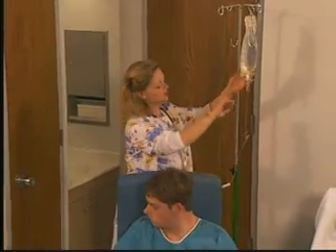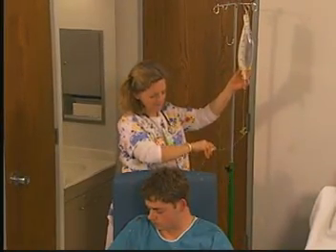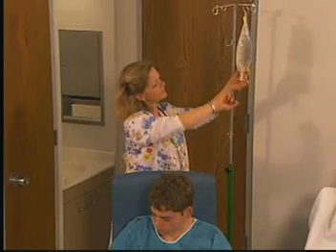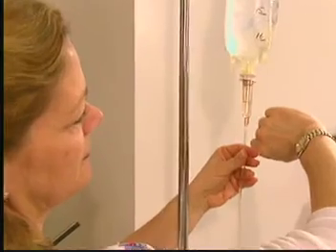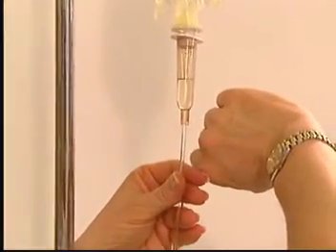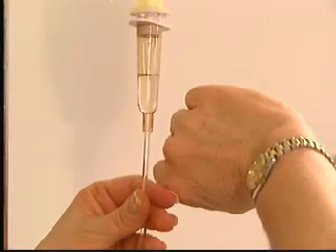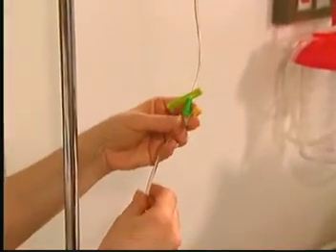Mr. Schwartz's IV is approximately 100 milliliters behind the volume that is due to be instilled at this time. A number of factors can explain the problem. First, check the drip rate. Use your watch to validate the infusion rate even if an infusion pump is being used. Here the nurse discovers that the IV is dripping at a rate slower than ordered.